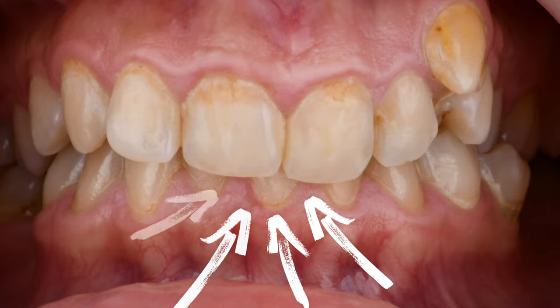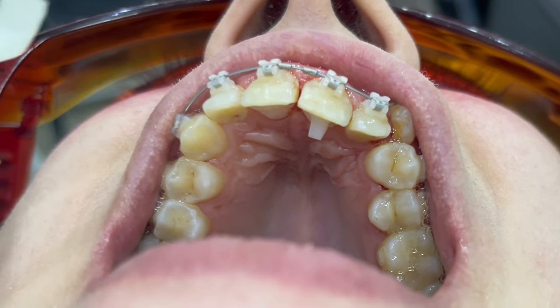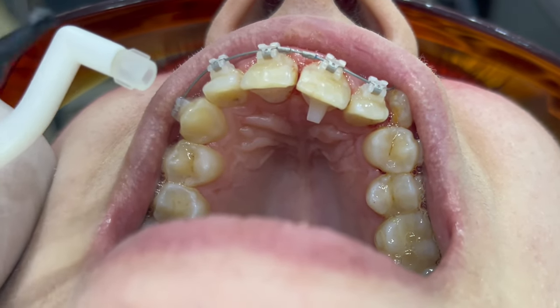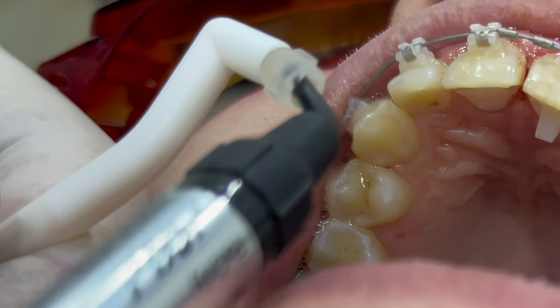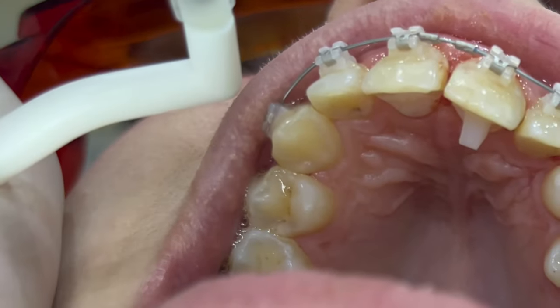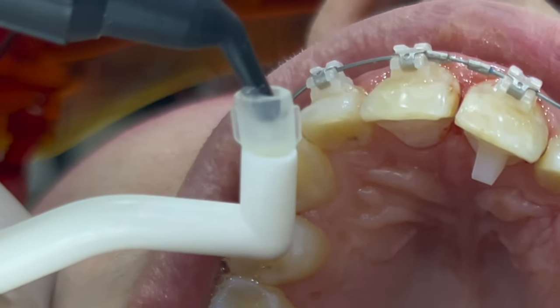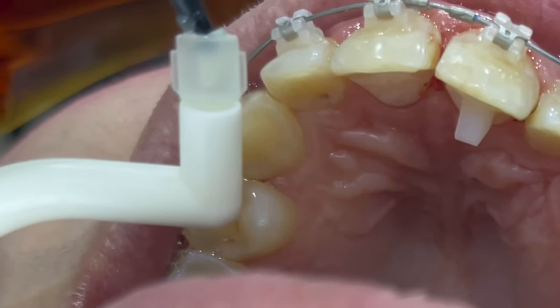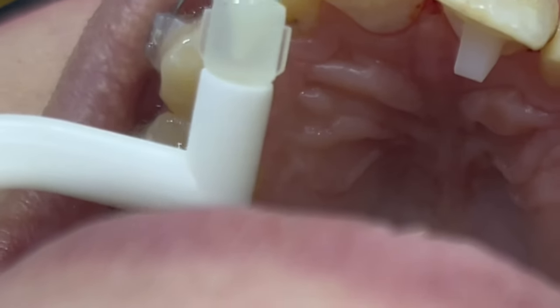In deep bite cases, it's not possible to bond the braces on the lower teeth immediately unless we do the separation. The separation could be anterior by turbos or posterior — a bite plane or bite separation, different names. The purpose of it is to make a space vertically for lower braces bonding.